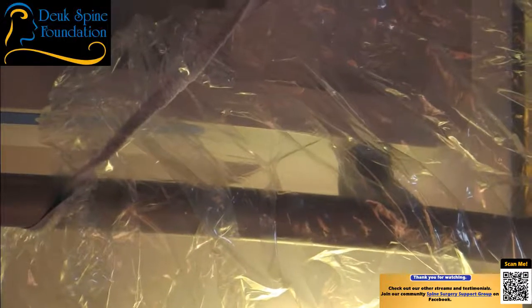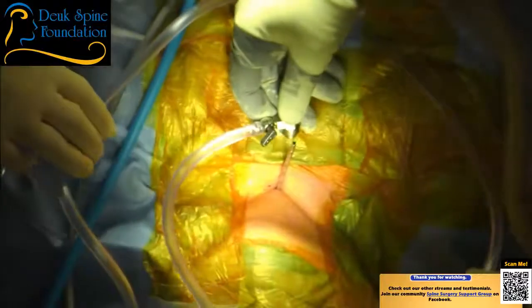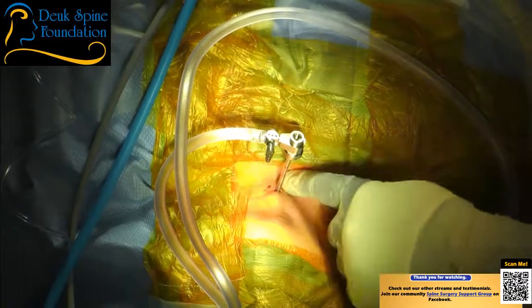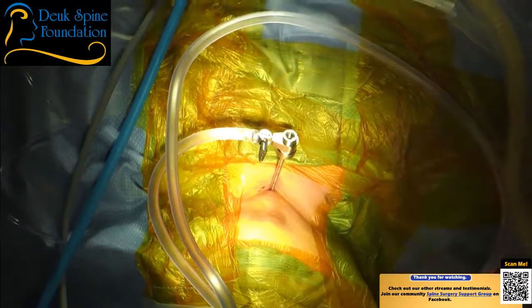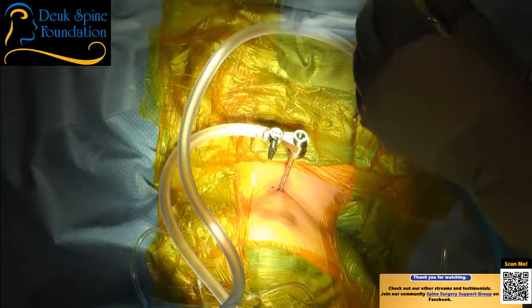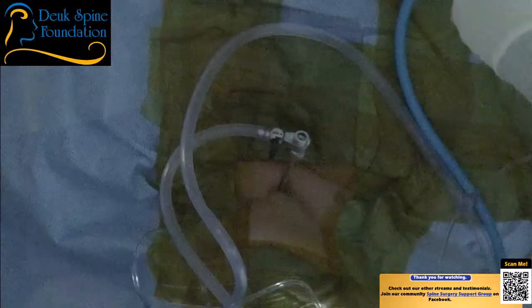All right. This is all endoscopic spine surgery. And in 2021, there's only a few surgeons in the world that do this kind of surgery. So you're not going to find this everywhere. Okay, we've been fortunate enough to be able to get into the first disc safely without incident. So now we just need to do the repair. And then we'll move on to the next one. Stop on, please.